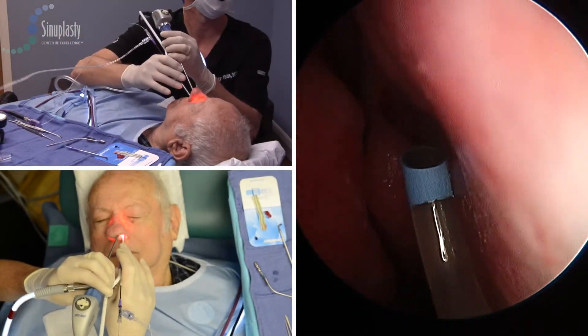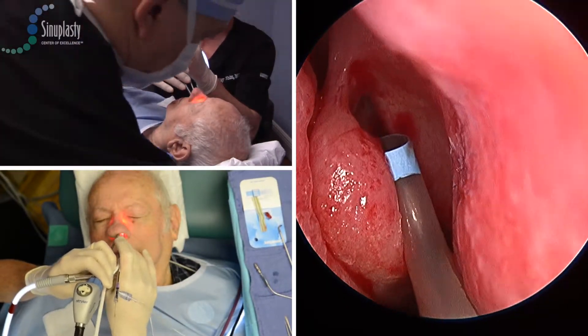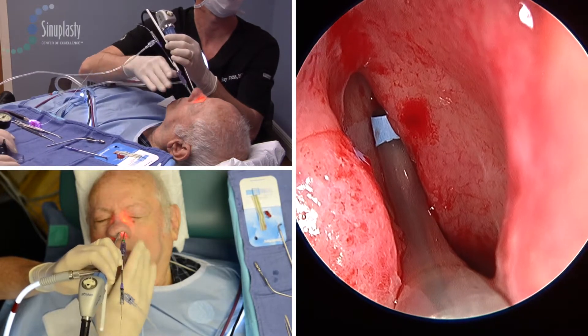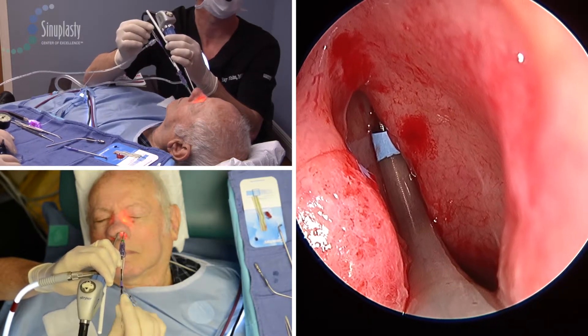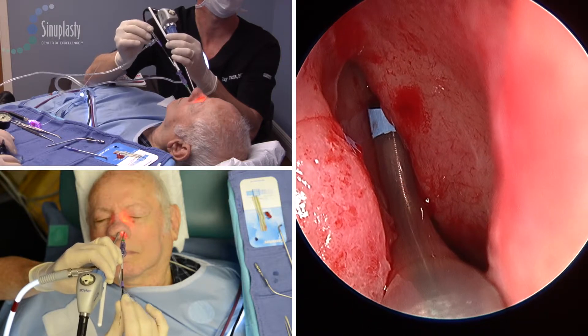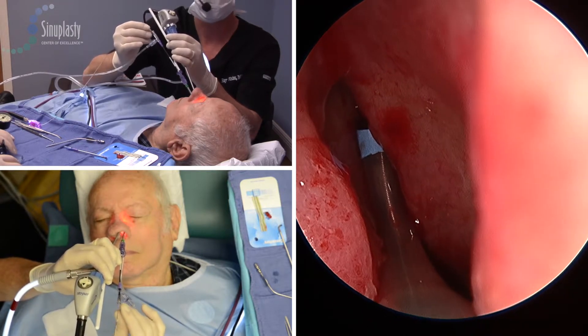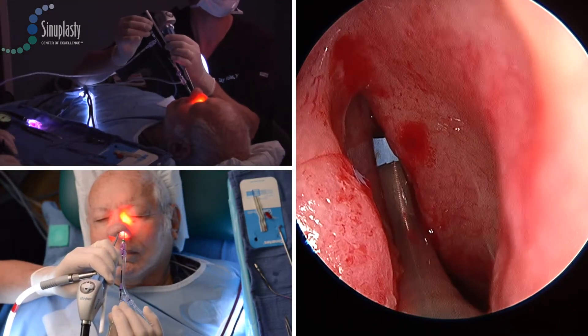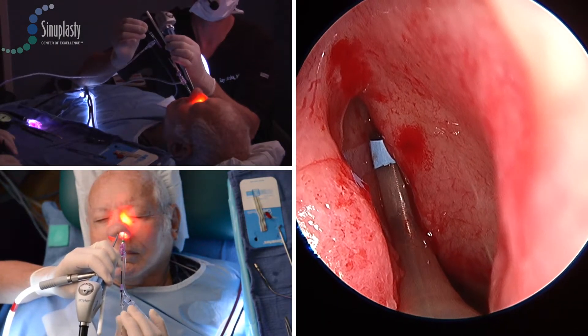This is a unique three-camera view of frontal sinus balloon dilation. Typically we concentrate on the endoscopic view, but these three shots allow us to look at the hands and the movements external to the endoscopic shot, and that allows us to coordinate the concept of what's actually happening to get us to the right spot endoscopically.